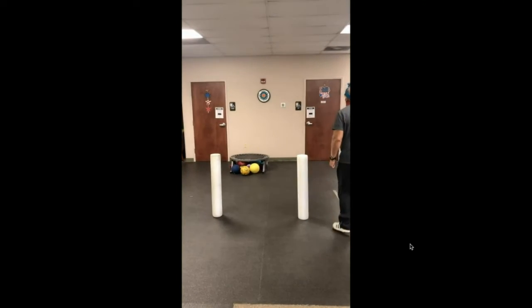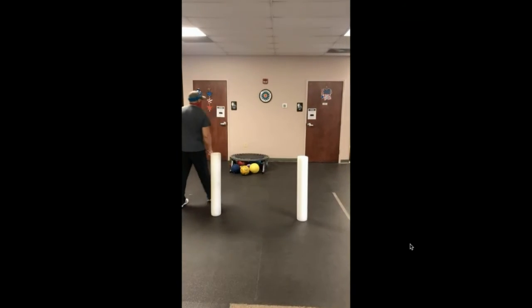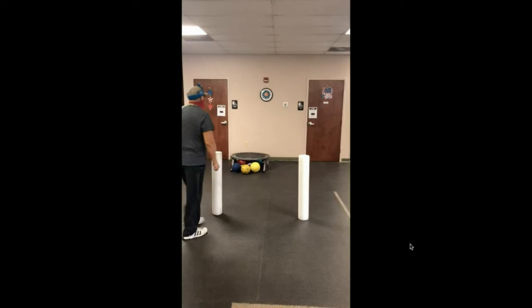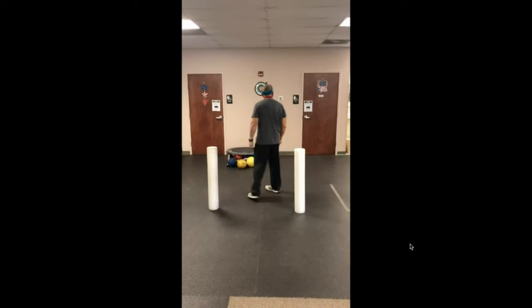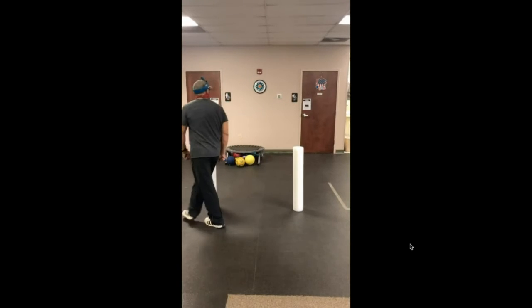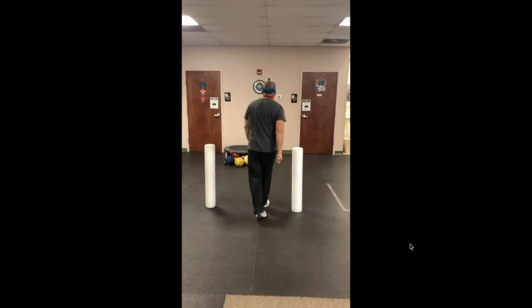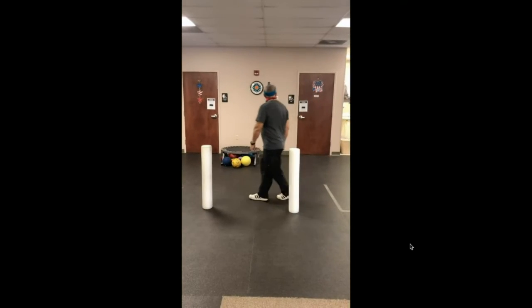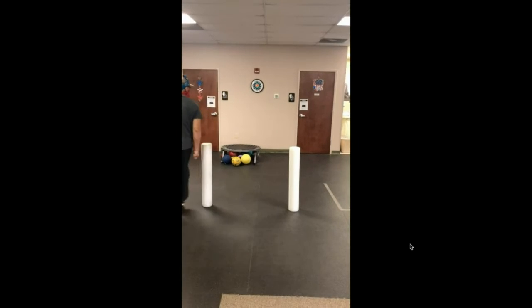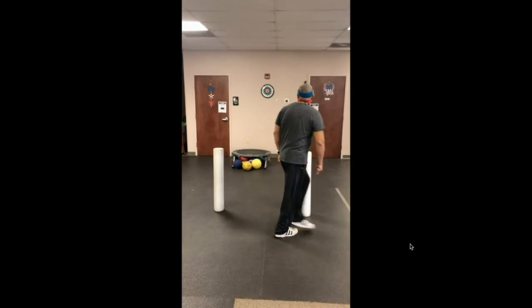You've seen that already once, and we'll watch this video again. But they just keep that centered up. They're going to be able to see with their peripheral vision where they are around those targets. And there's a consequence for these particular targets. So if you rub into the foam rollers, we'll talk about that there in a second. They could knock those over pretty easily. It's going to give them a sense of motivation to not do that.